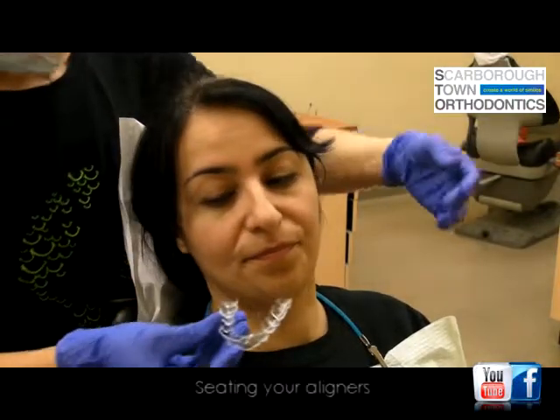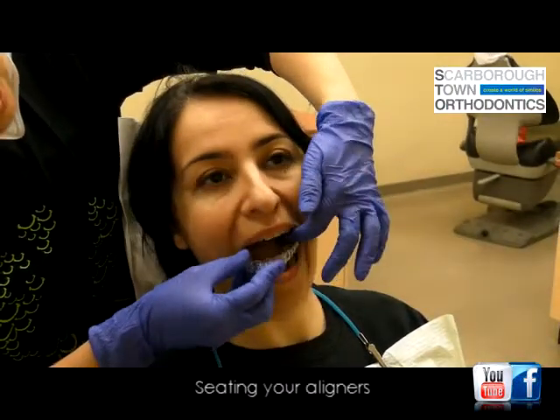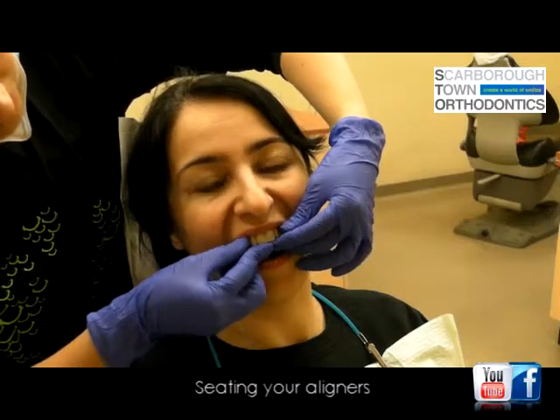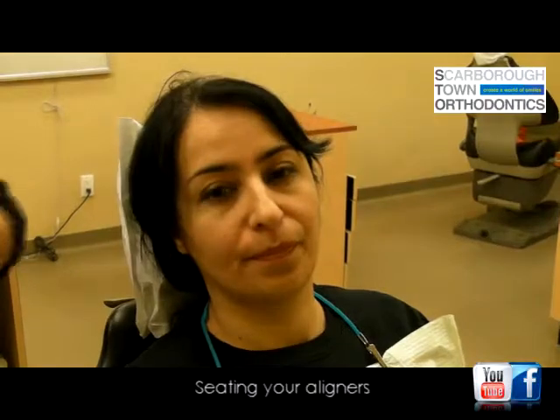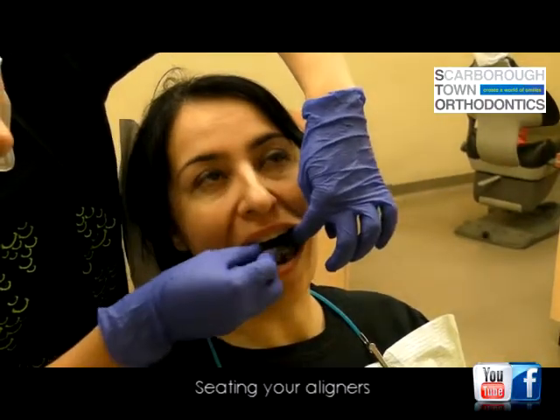So we are going to seat these aligners. And for the top, I'm just lining it up with her front teeth and just giving it a good push all the way around. Same for the lower.